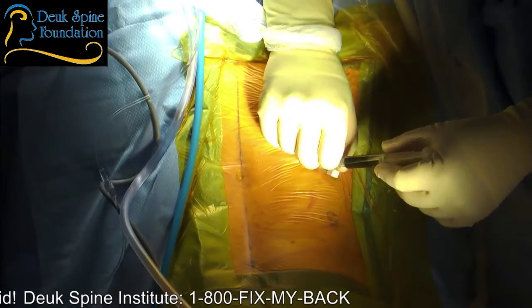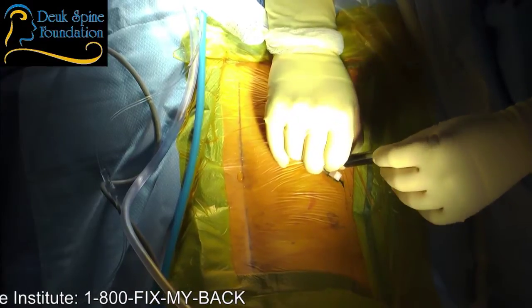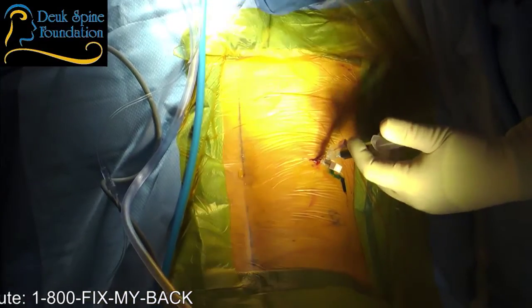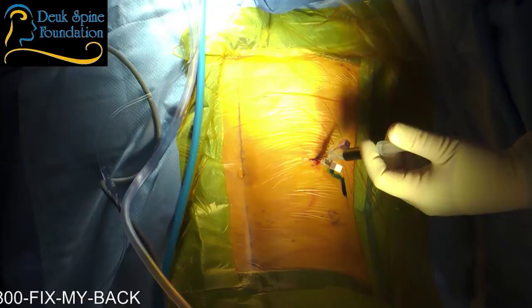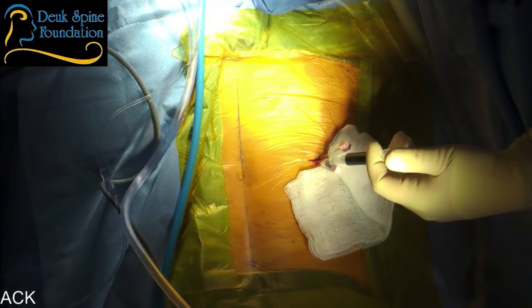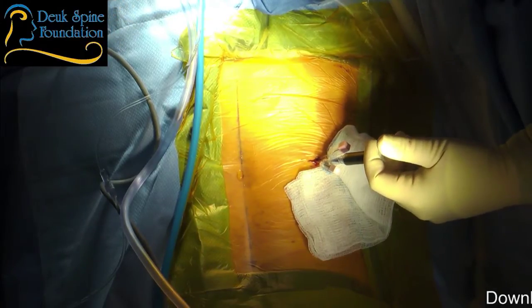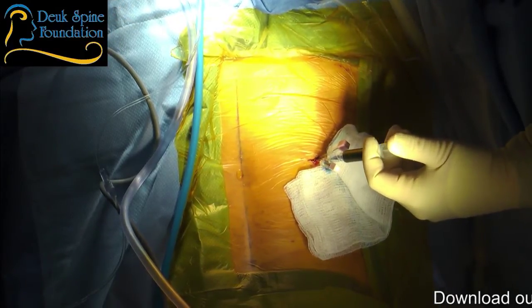But once I access it, and everyone's different, she was pretty easy, to be honest with you. We got lucky with her, but a lot of times I'm struggling to get in. But once I get in to the 3 discs, then I'm going to do a discogram. How long does the fentanyl last anyway? Like 20 minutes, 15 minutes? Less? Longer than that?